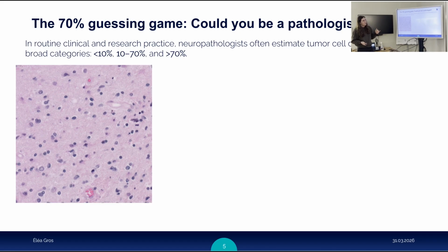This caused a problem, so I'm going to take you on a game and play the role of pathologist, and we will try to see what the problem is together. This is an example of an H&E patch, and I'm pretty sure everything I included is astrocytoma. This is a patient that had an astrocytoma. In this patch, there are 55.52% tumor cells. This was quantified using immunohistochemistry.